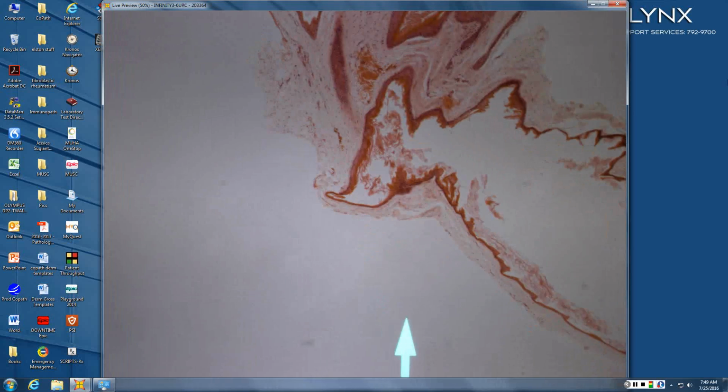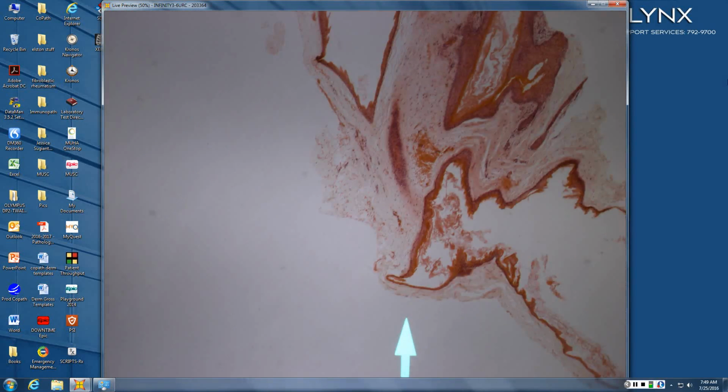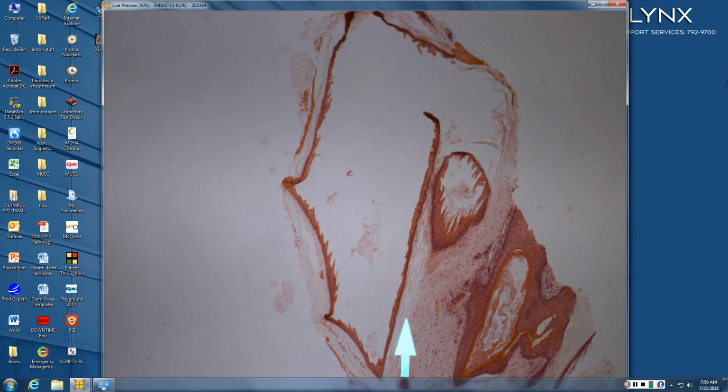that was good. You actually get points for that. That was very good. So this one has no sebaceous glands in the wall whatsoever. Is it still a steatocystoma? I think so. Yes, because it is. It is completely recognizable sans the sebaceous glands. And so that's the whole point, that you need to be able to recognize common variants of things or uncommon variants of common things.